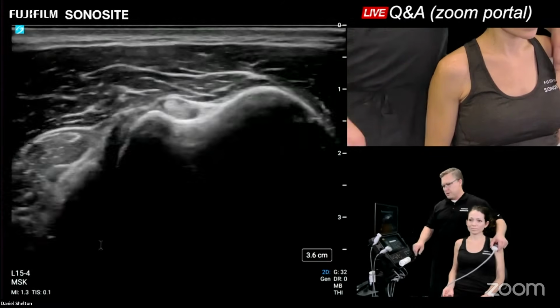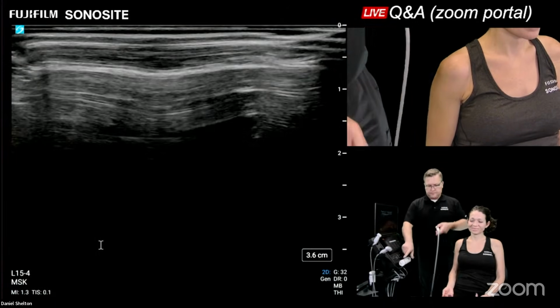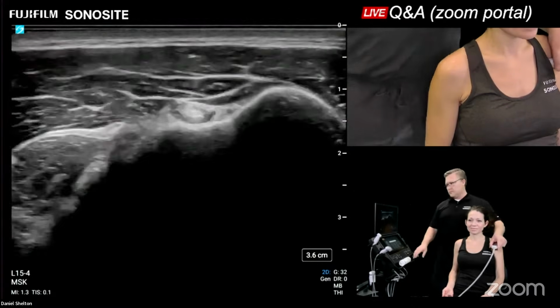There, just to be thorough. It's more fun to scan the one with fluid around it. So let's go play around that one for a minute. We actually have a follow-up to the last question here.